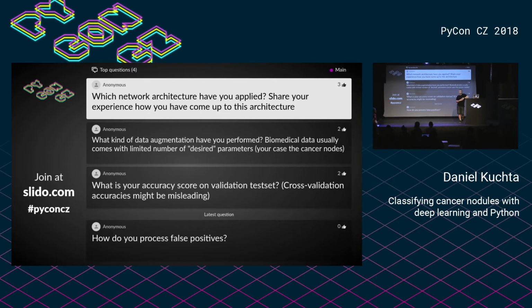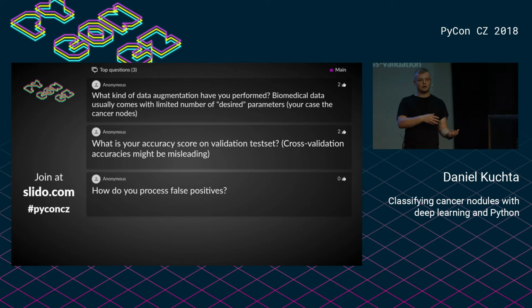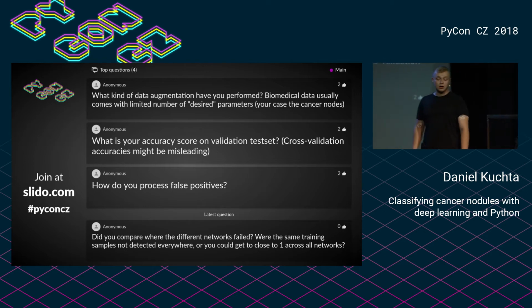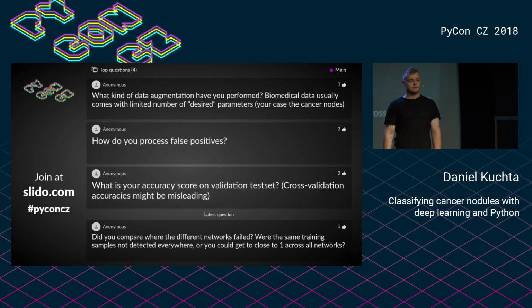And the second network was just a standard feed-forward neural network with, if I remember that correctly, 2 hidden layers and a bunch of neurons. But this was just to correct the predictions of the convolutional network in front of it. Then we had, again, two networks for classification of nodules. The first one was, again, a standard feed-forward neural network, nothing special.